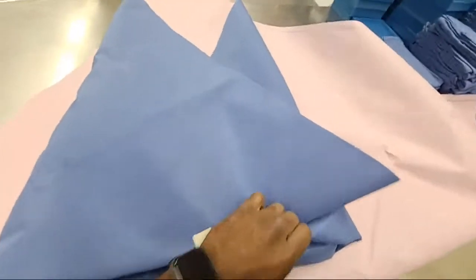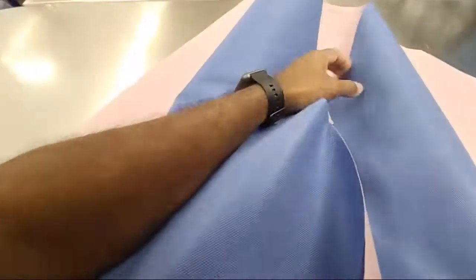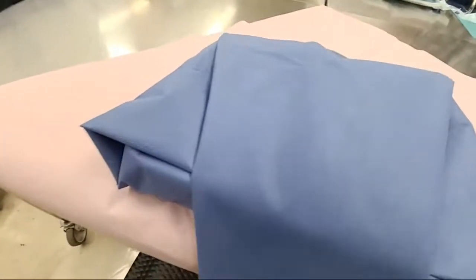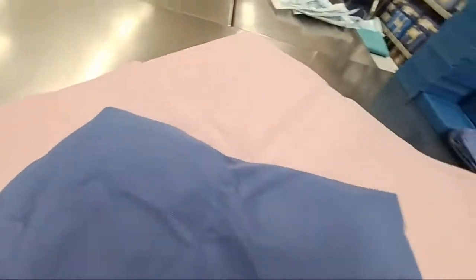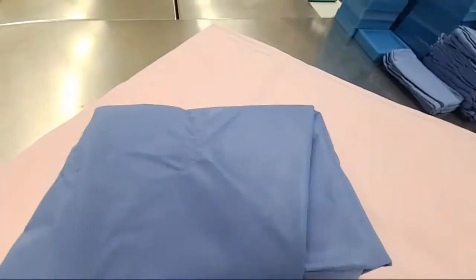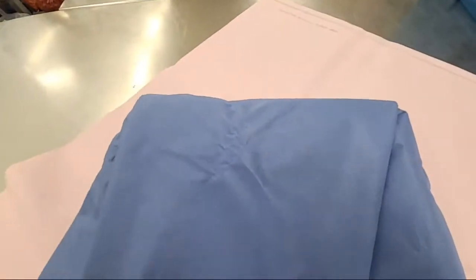I wrap much nicer with two hands. But it's going to be like that. We can roll this back over a little bit. And then tuck this part in, tuck this part in. There we go. And this is an ugly looking wrap. But pretend it was more beautiful than this. Just live in the moment with me.